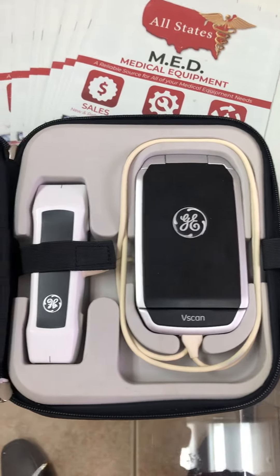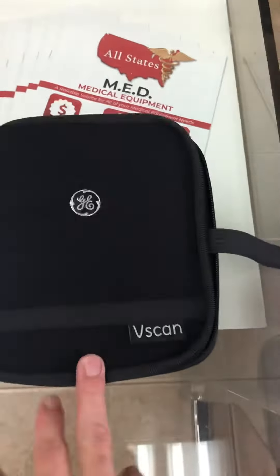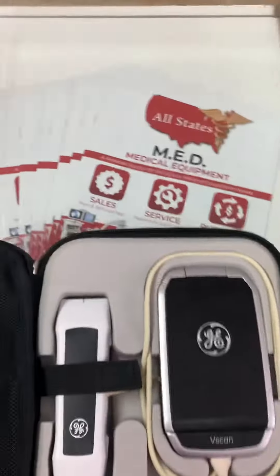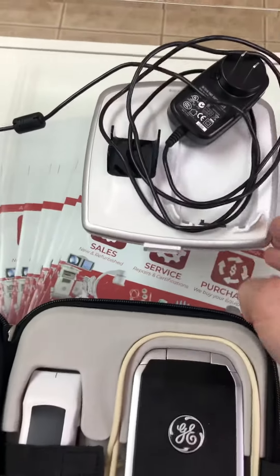Here we have the GE Vscan Dual Probe. It comes in a carrying case with the docking station and charger.